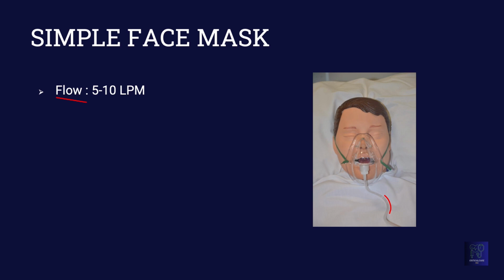But even at 10 liters per minute, that is not going to be enough to meet the patient's peak inspiratory flow demand, which will be upwards of 20 liters per minute. So the simple face mask has these holes or perforations which allow ambient air to enter. So there is mixing of 100% oxygen and ambient air.